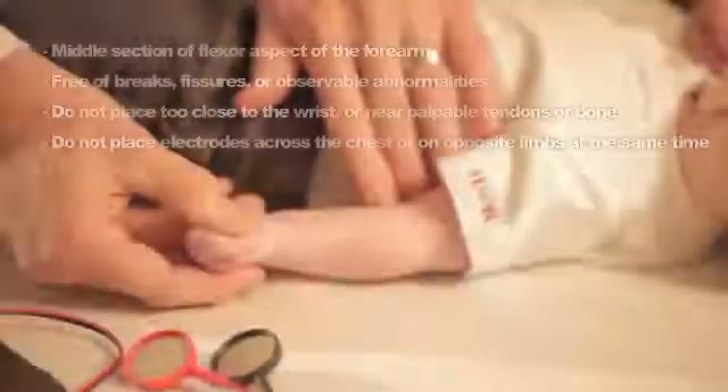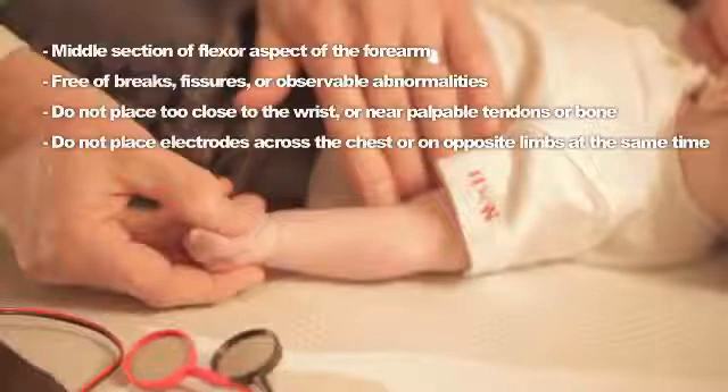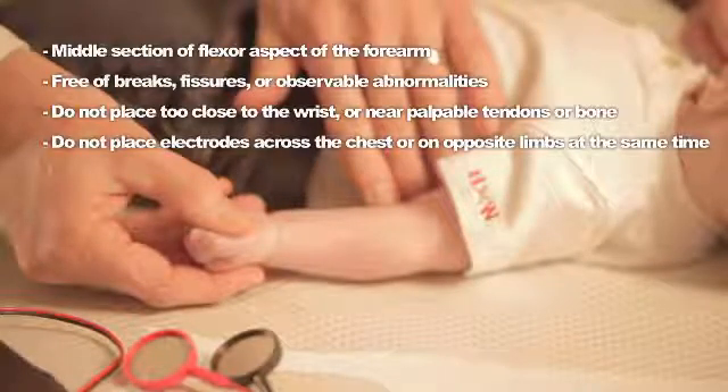The preferred location is the lower section of the flexor aspect of the forearm for high density of sweat glands. The selected site must be free of breaks, fissures, or observable abnormality in the skin. There should be no signs of inflammation, and the area must be as wrinkle-free and hairless as possible.